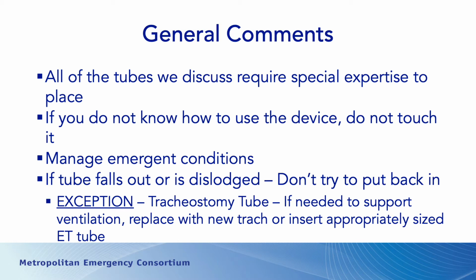The only exception to this comment is if you have a tracheostomy tube that has fallen out or is malfunctioning, and that tracheostomy tube is necessary to support the patient's ventilatory machine, or the patient's on a ventilator, they're vent dependent, or they have to have the tracheostomy tube in place in order to maintain an adequate airway.